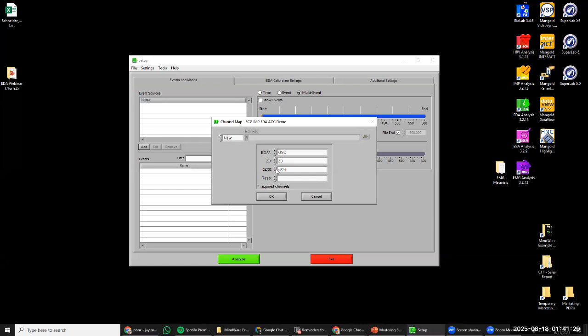And so having respiration synchronized with our skin conductance responses is crucial, and it's really mandatory if we're looking to report on SCRs, because we need to be able to differentiate the two, identify respiration-driven SCRs, remove that effect, and so you'll need to control for respiration in a certain sense.